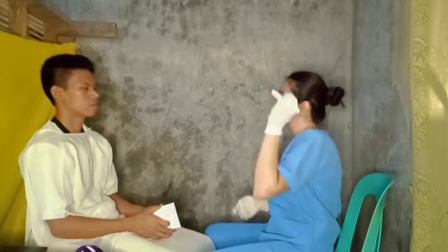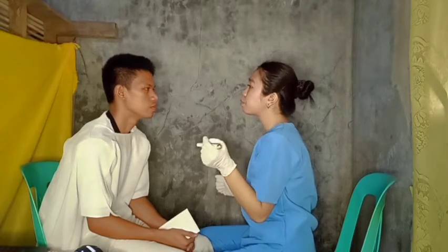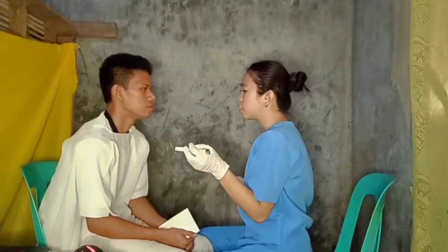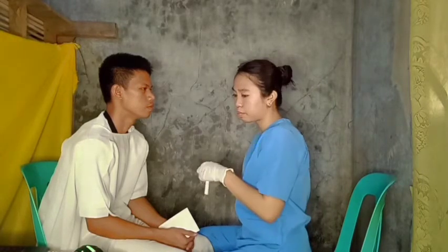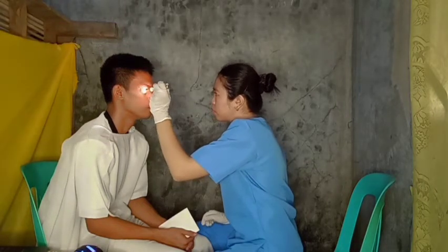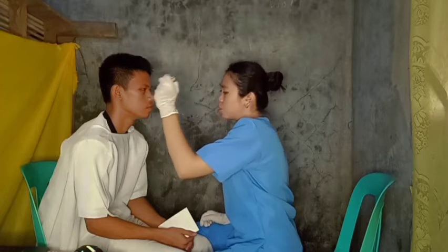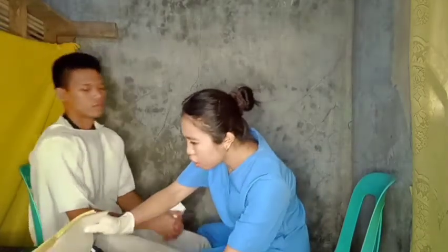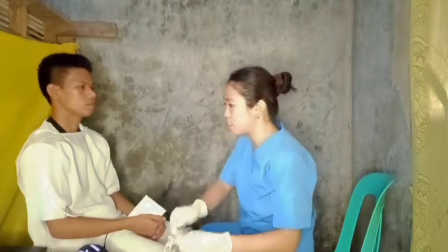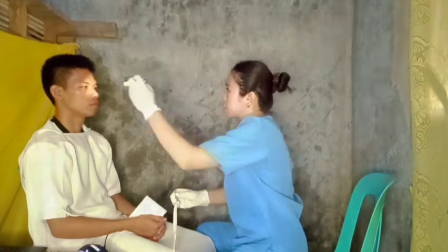So our next test is the iris pupil. Can you please look at me, sir? Okay, I'll be using my pen light to check the functionality of it. Okay, sir, can you please look at me? Okay. So, sir, I will be measuring the size of your pupil. So, kindly look at a distance.